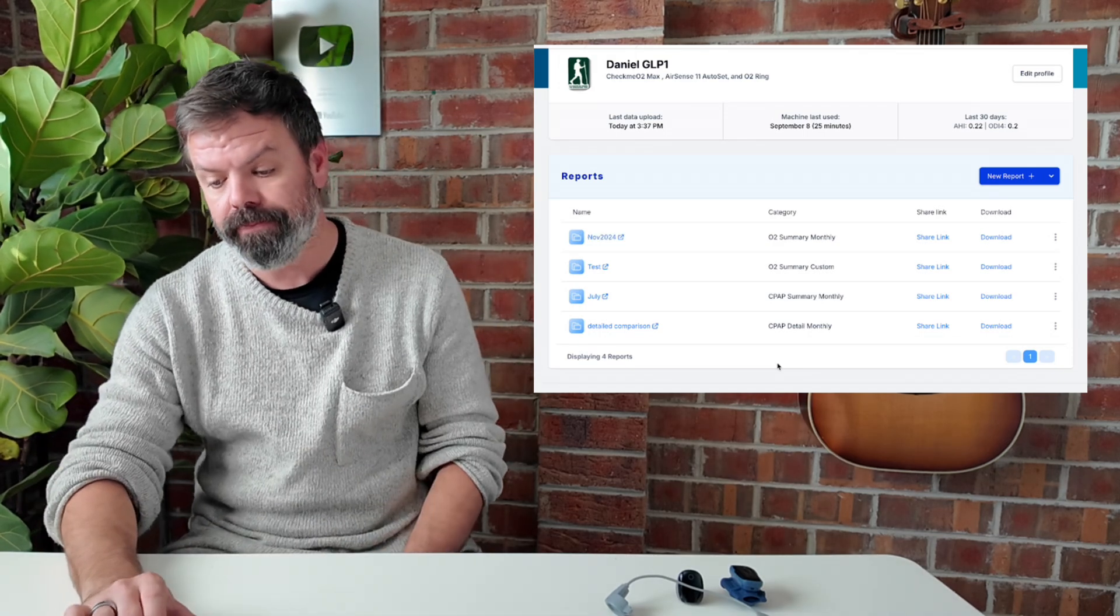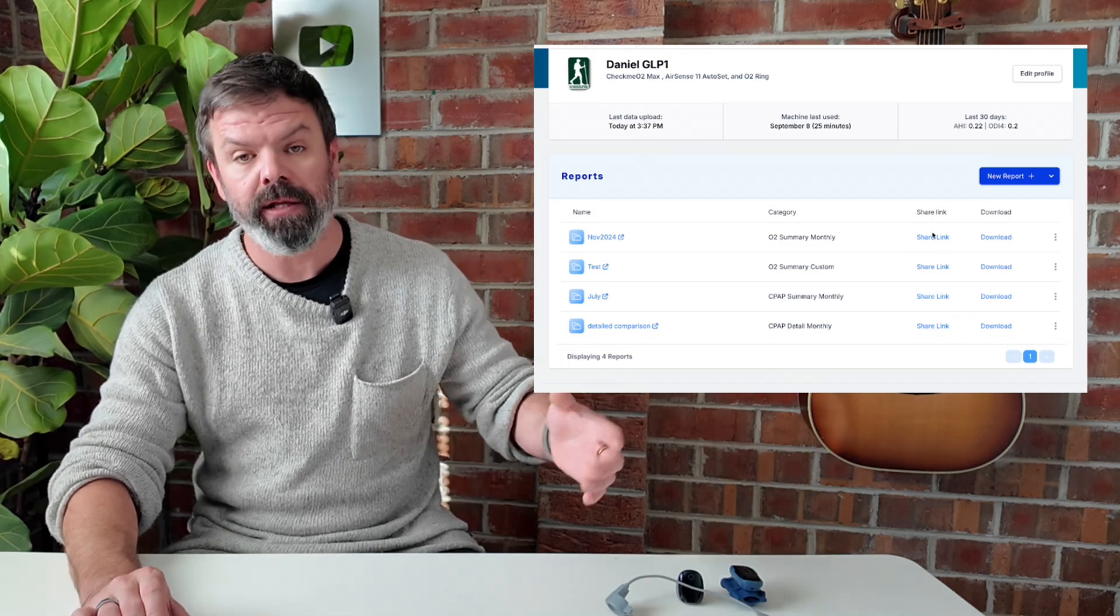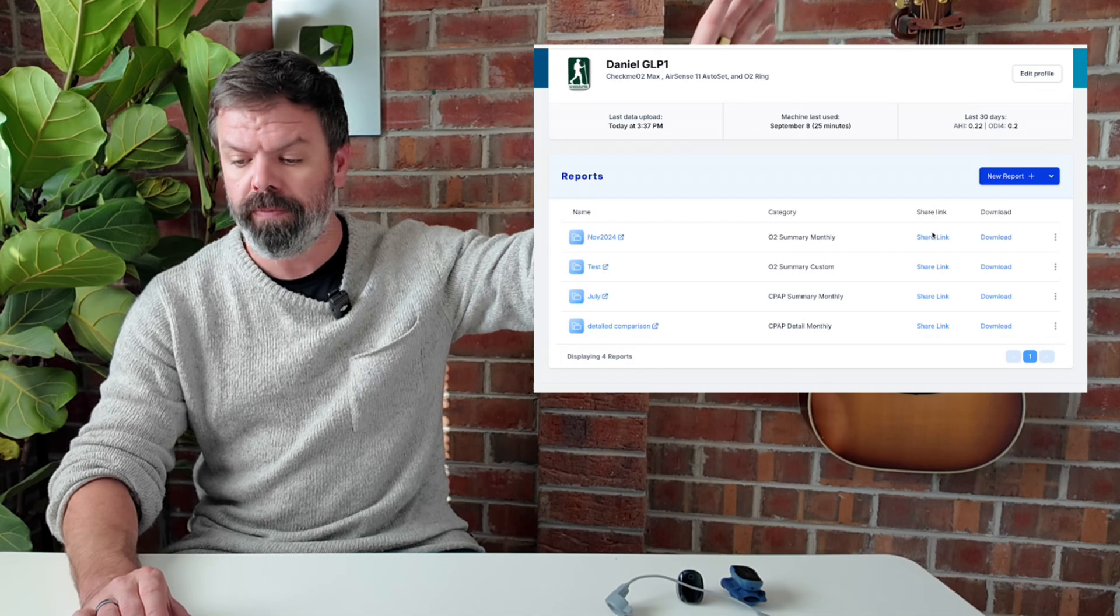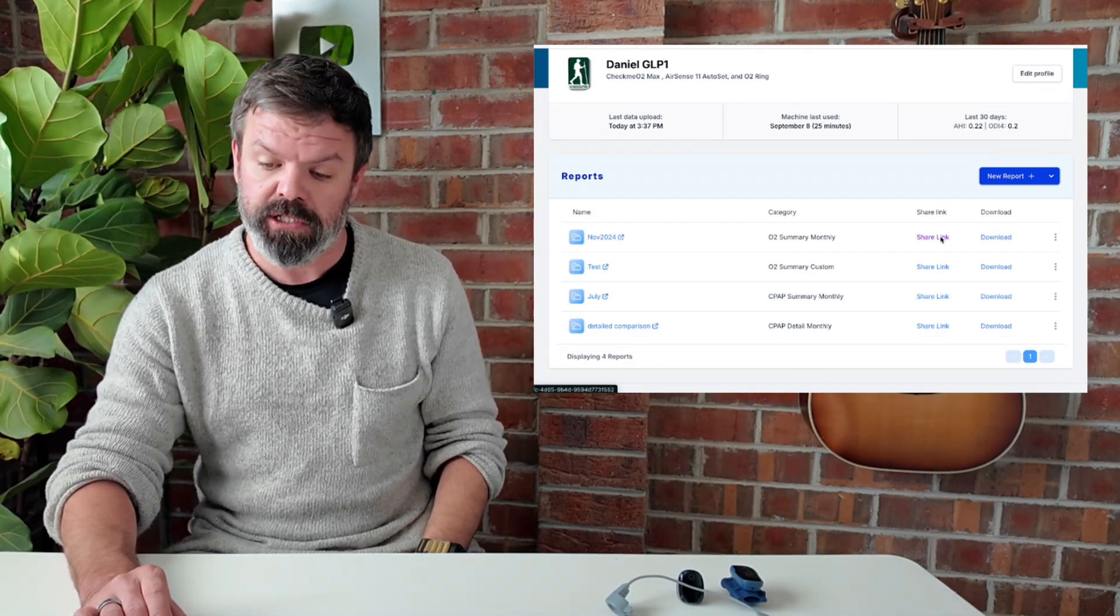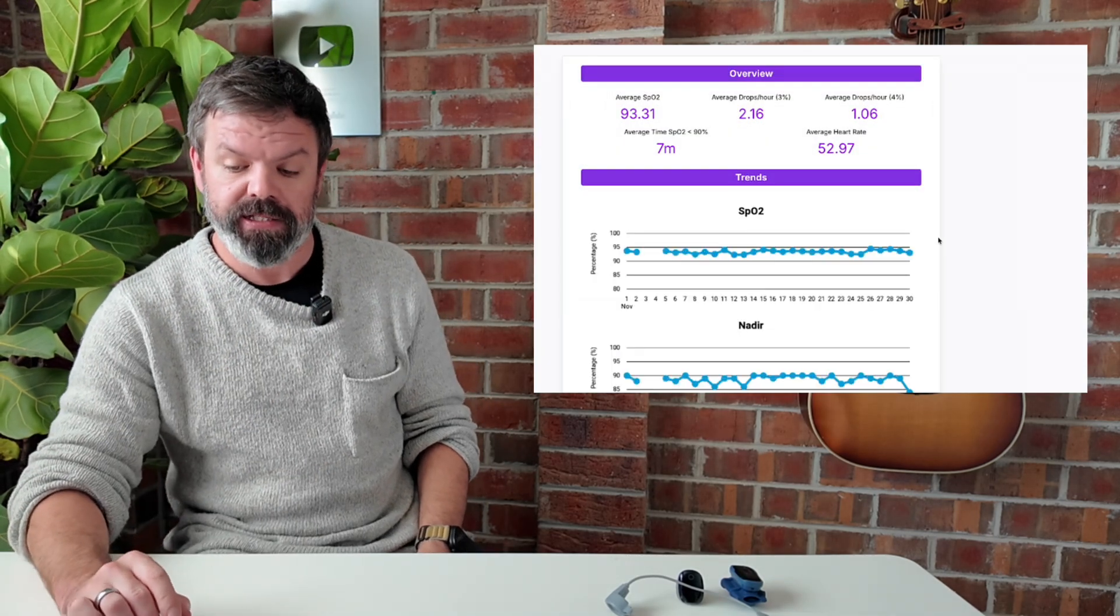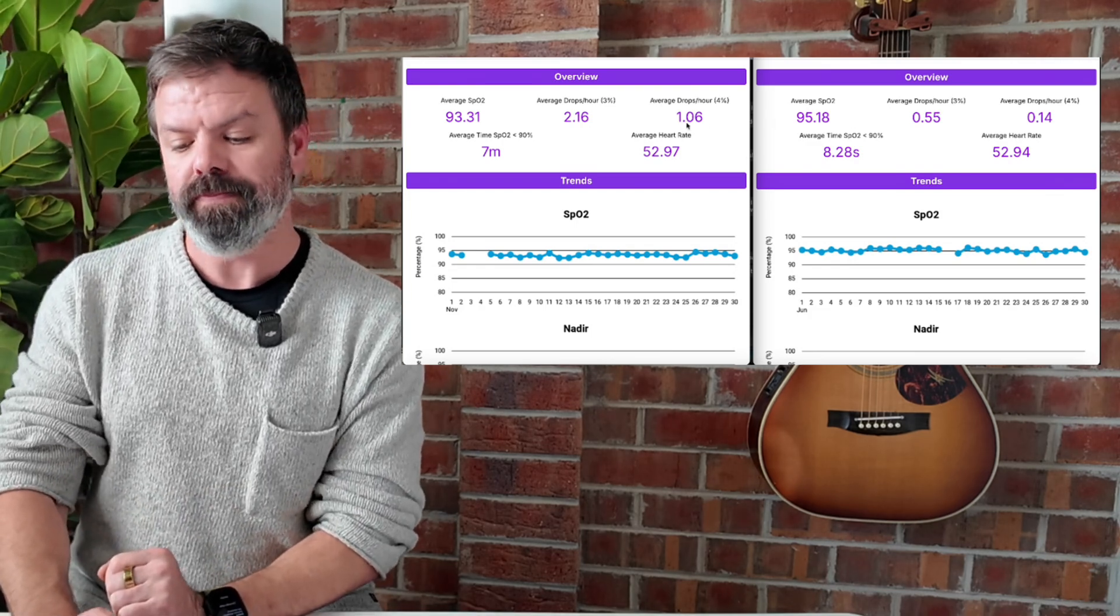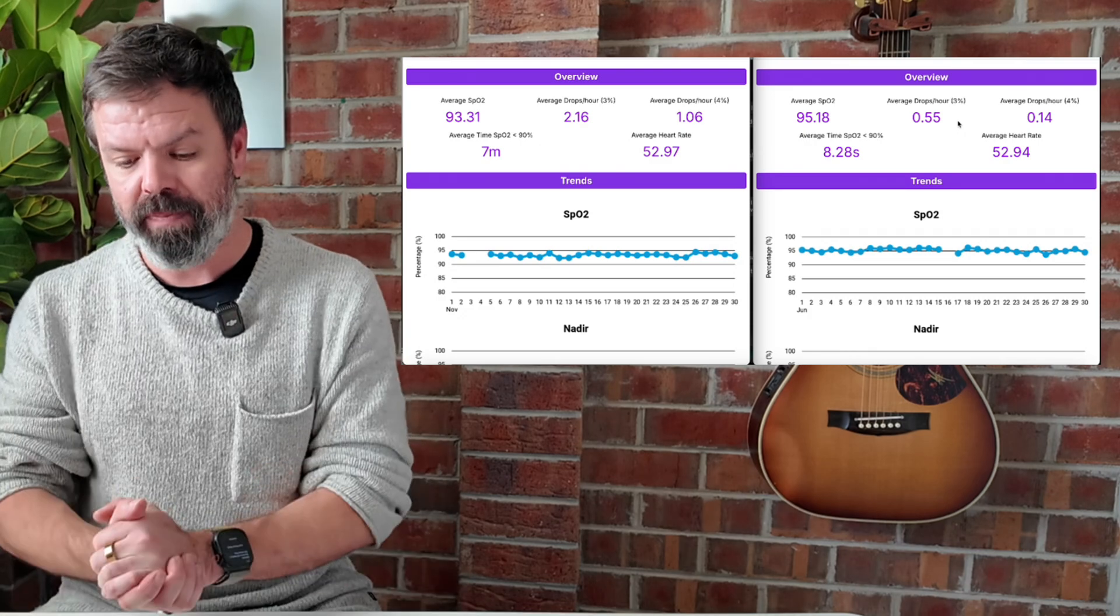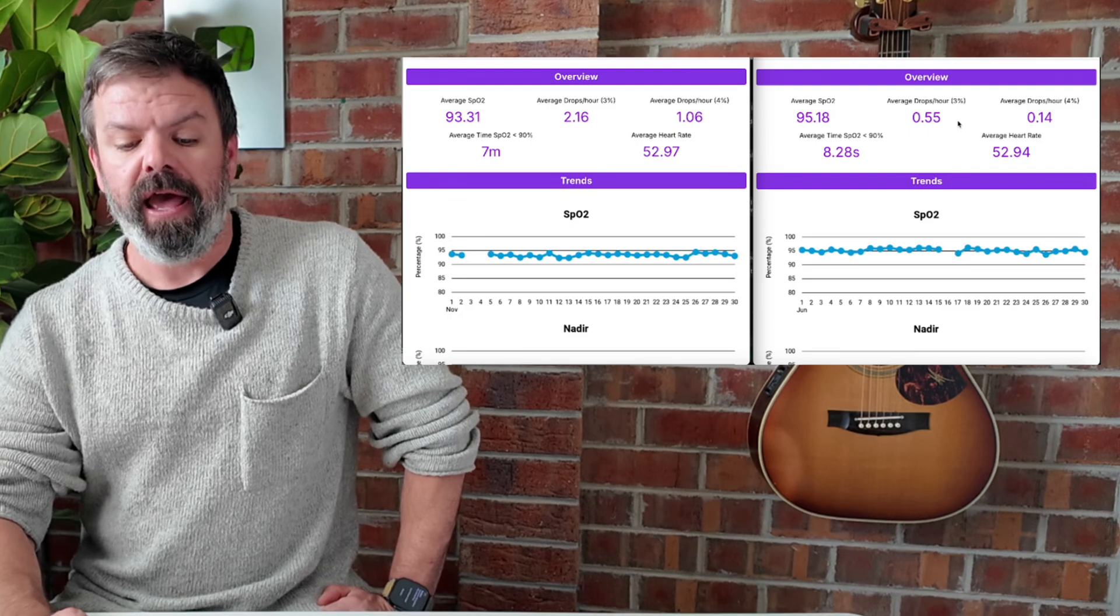There we go, it's done. So we've got two options here. We have a share link. This is an anonymous share link that you can paste in a browser anywhere, put it on a forum, you're good to go. Or we can download a PDF. So we'll just click the share link here. And here's the new report. So here we go. November 2024 versus June 2025. Let's compare the results. He's lost a lot of weight and it's looking really nice.